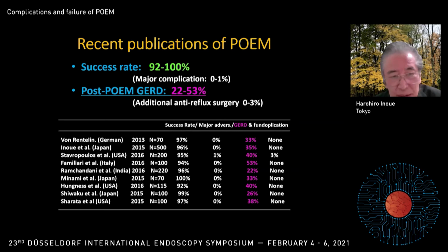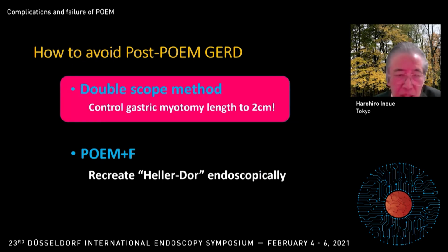As you know well, POEM has a high technical success rate, but in 20 to 50% of cases patients develop postprocedural GERD. Most of them are mild GERD. Anyway, in order to avoid postprocedural GERD, we recommend the double scope method.